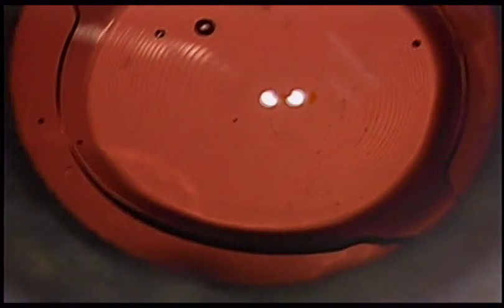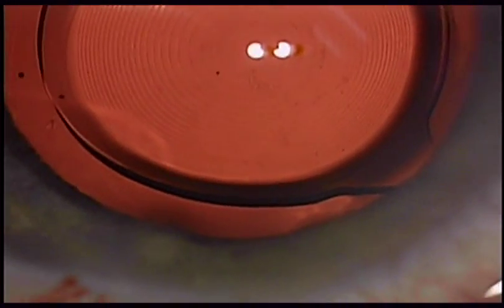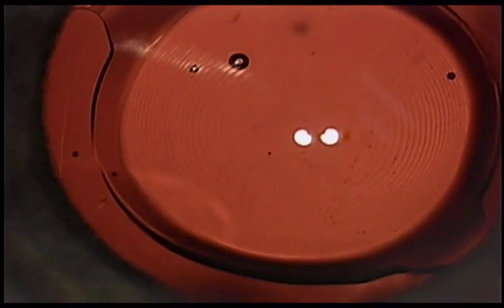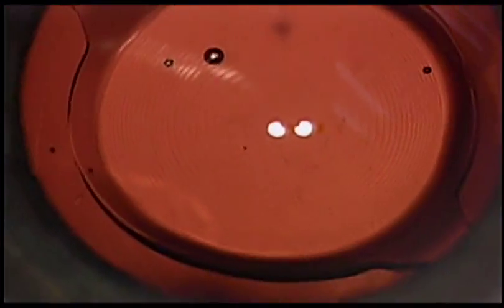At the end you'll see that I focused on the rings, and at the very end I'll ask the patient to fixate carefully on the microscope filaments, which will show this lens is perfectly centered. And there you have it.